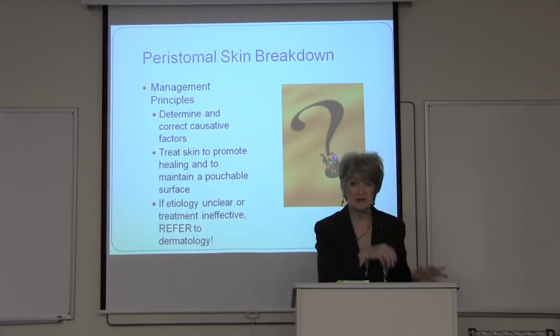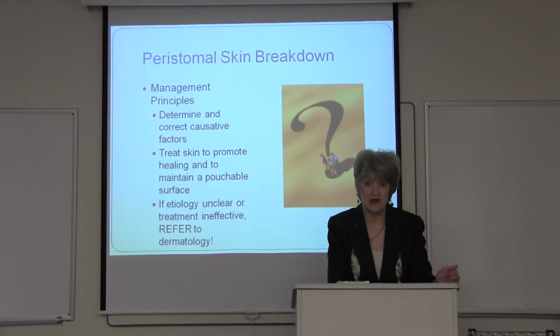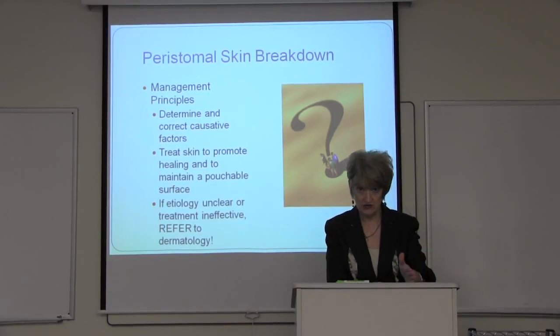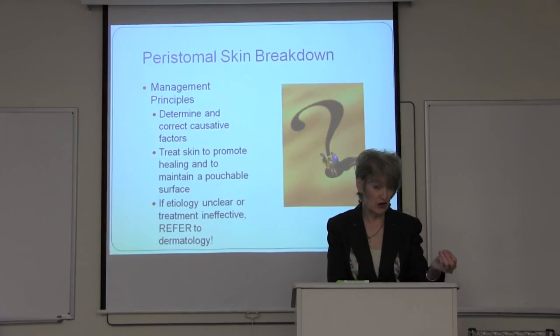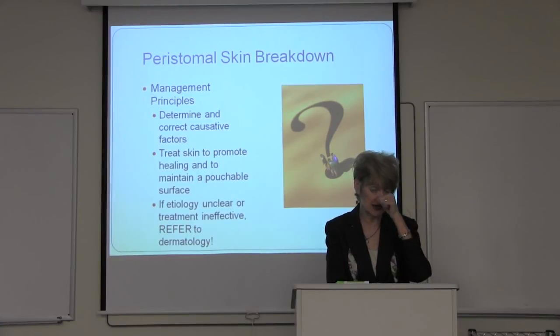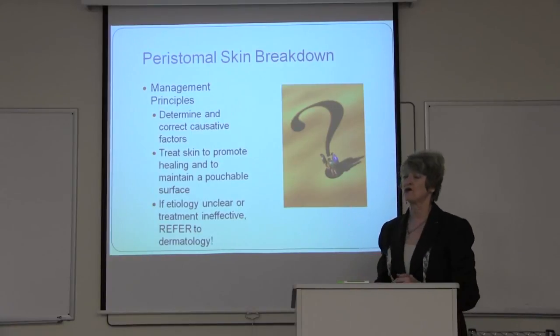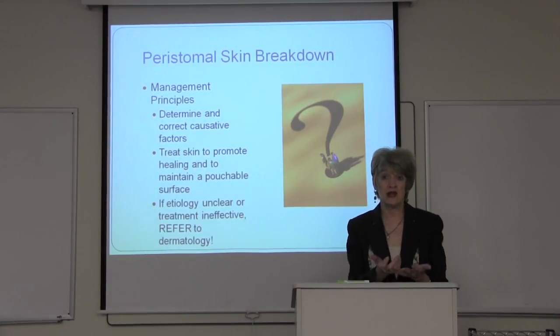One thing I forgot to mention, and I apologize, I forgot to talk about the indications for PRN pouch change. And you want to teach patients, you're going to change your pouch at these fixed intervals. But anytime you realize that your barrier is softening and loosening, change your pouch. Anytime you have peristomal itching or burning, change your pouch. Don't wait, because your skin is being damaged. So now we're going to talk about peristomal skin complications.